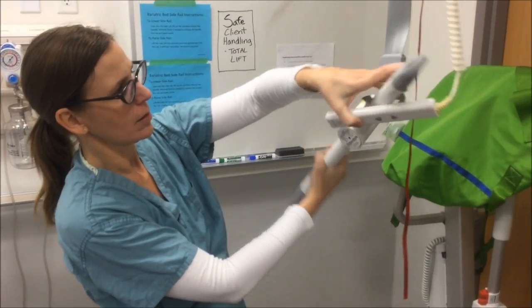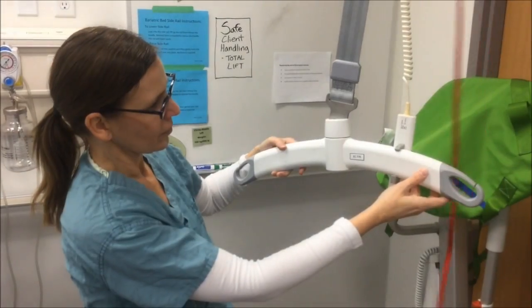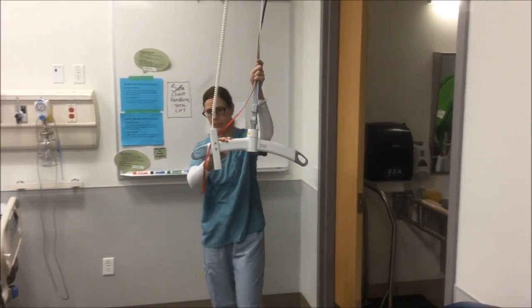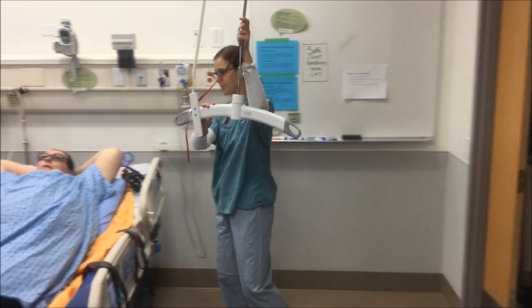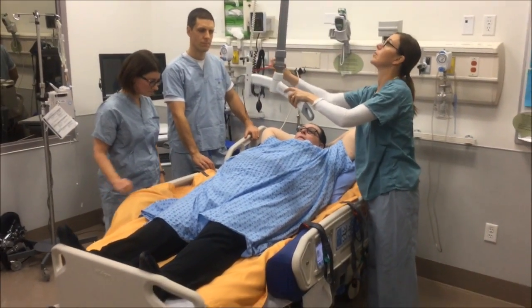Inspect and prepare the equipment and confirm its weight capacity. The lift is shown here as EC770 to discreetly indicate extended capacity up to 770 pounds. Ensure that the total lift batteries are charged and that the lift is operational. A ceiling lift is used here, but a portable lift would also work.